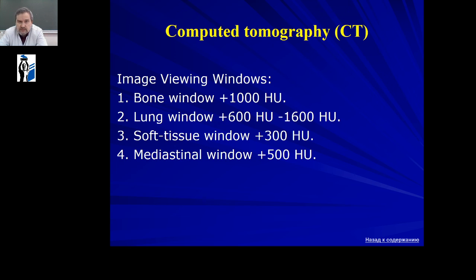And last slide about computer tomography. You have to remember the image viewing windows. Some organs are better viewed in some Hounsfield units.